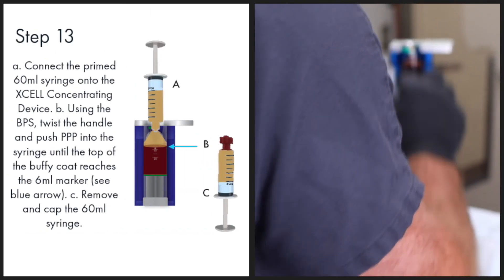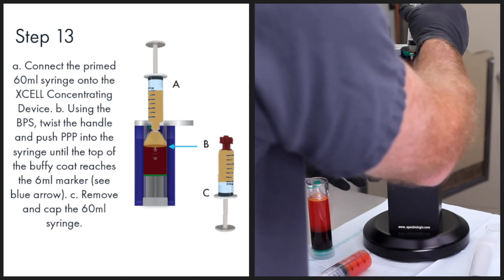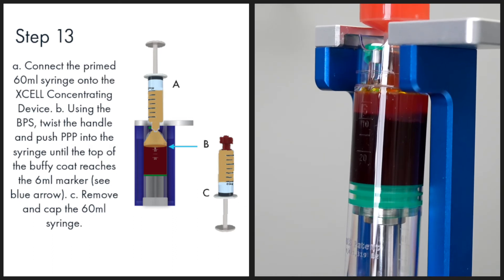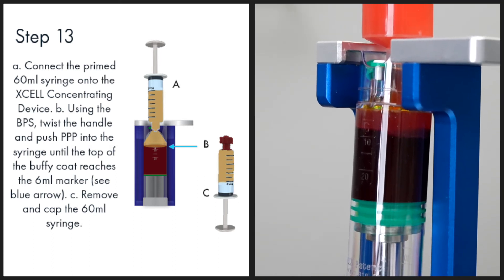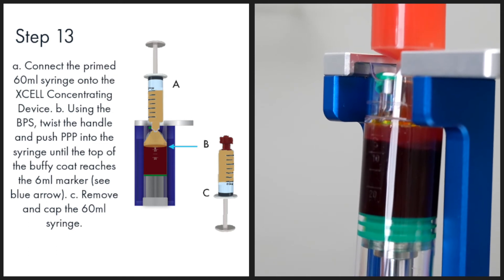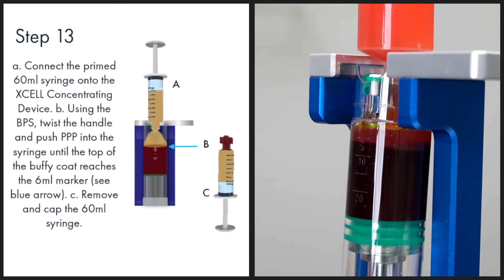Connect a primed 60 milliliter syringe onto the concentrating device. Using the benchtop press, twist the handle and push platelet poor plasma into the syringe until the top of the buffy coat reaches the 6 milliliter mark. Remove and cap the 60 milliliter syringe.